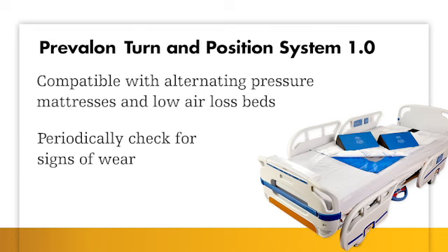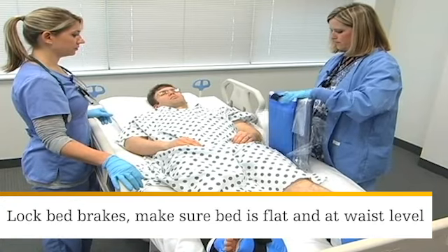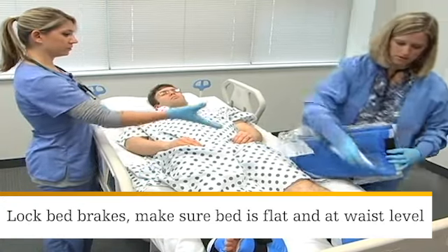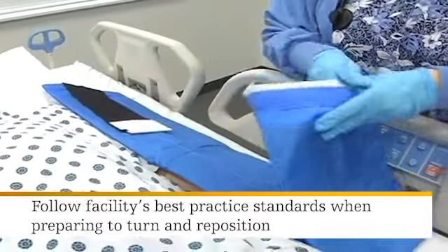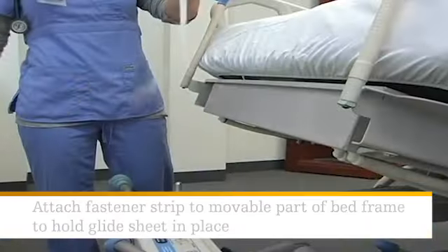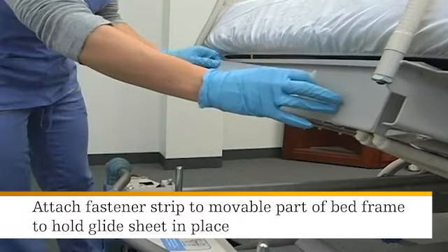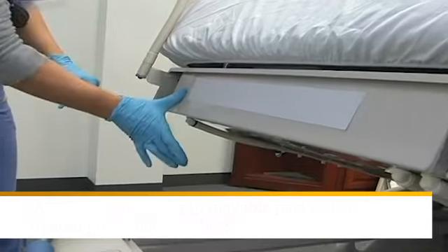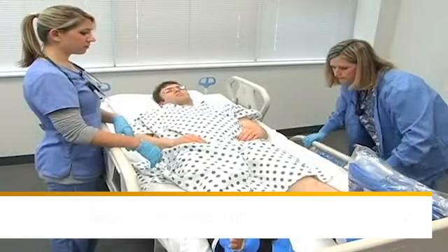Periodically check the product for signs of wear and replace the product if damaged. Before using the Turn and Position System, make sure the bed brakes are locked, the bed is flat if patient condition allows, and at waist level. Follow your facility's best practice standards when preparing to turn and reposition. Attach the fastener strip to the movable part of the bed frame — this will be used to hold the glide sheet in place. Do not apply the fastener strip to the headboard or stationary part of the bed.